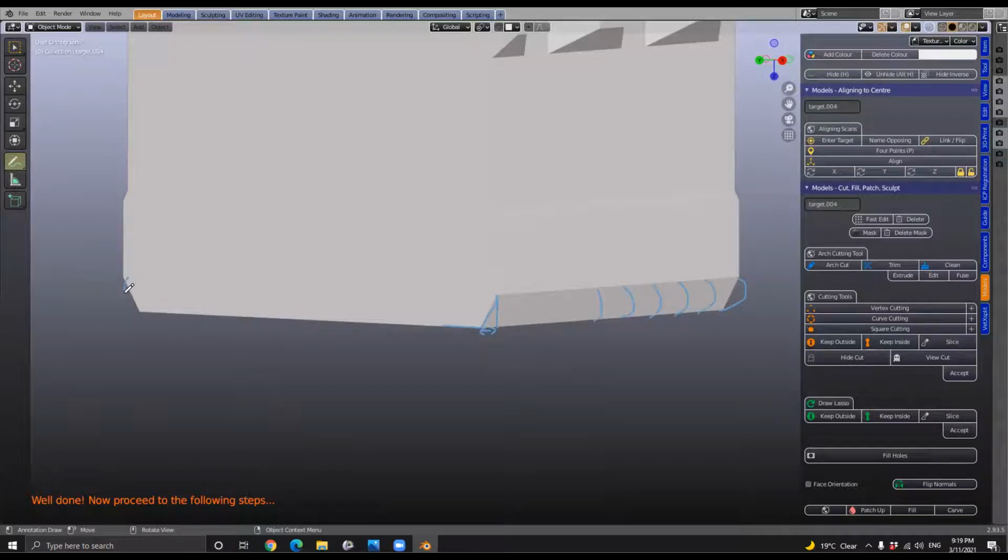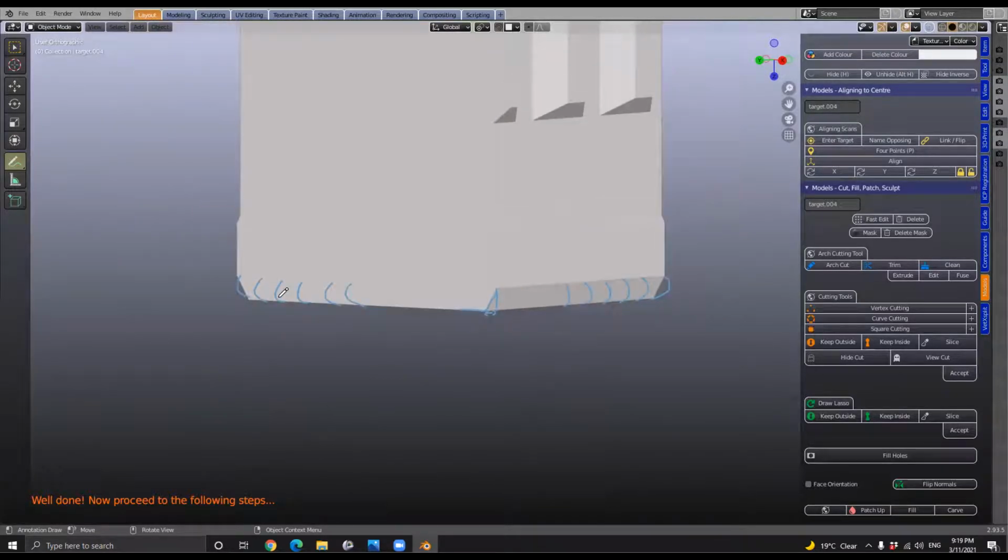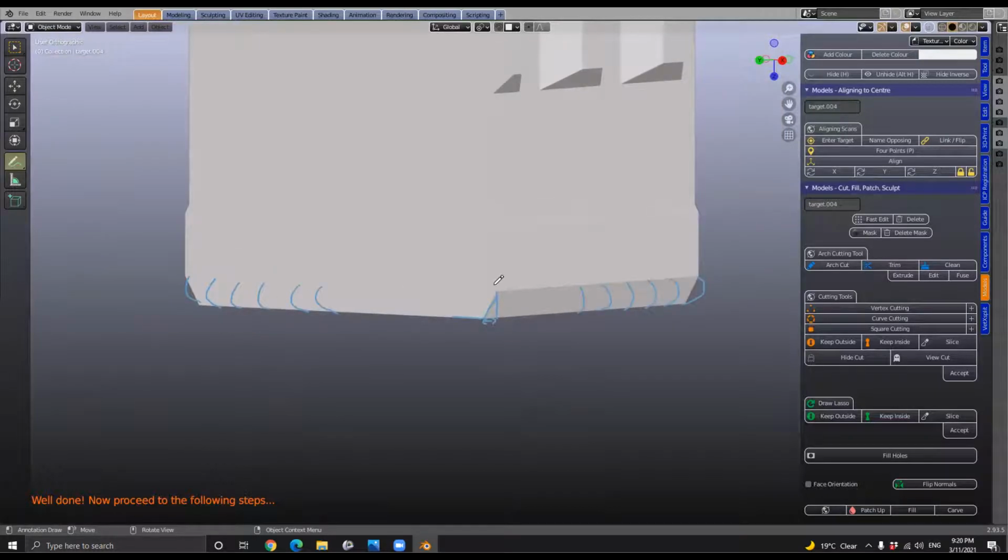So Wolfgang, the burn layer would somehow look similar like that. It's like a beading that goes around the die. Is that correct? That's correct. And this is why I usually slice at 0.2 thickness. But if you want to go thinner, like I said, mesially and distally, give it 2 swipes over sandpaper and that is gone. Yeah, so that's important to note.